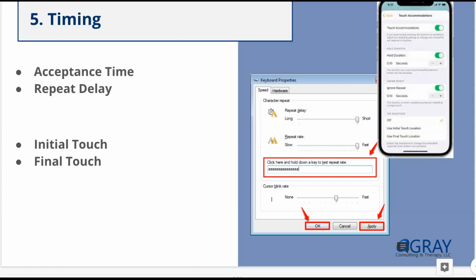And so for some individuals, it can be really helpful. They might push on a button and then their finger slides kind of off the button. And if they would prefer not to use a key guard to help with that, they can get onto the screen, but once they're on it, they can get to where they need to be, and then they release the screen in the right spot. So those can be really helpful.